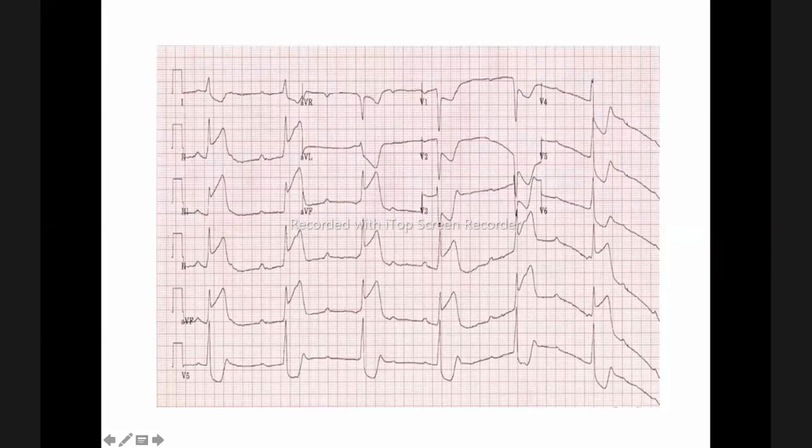Yes. Then let's look for a relationship between the P and the QRS. There it looks like there's a P, then a QRS, the interval must be okay. Then there's a P, it's prolonged here, then it comes. Then here there's a P. You look at this here, it's becoming progressively longer, QRS. Then here there's a P and no QRS. Then another P. The relationship is not very clear. There is AV dissociation here.